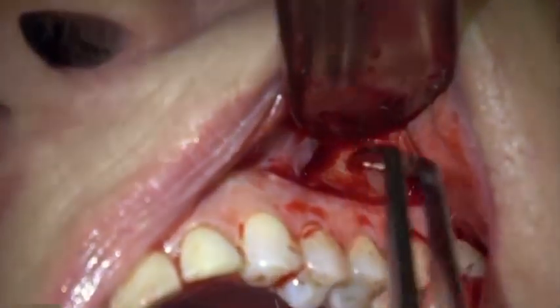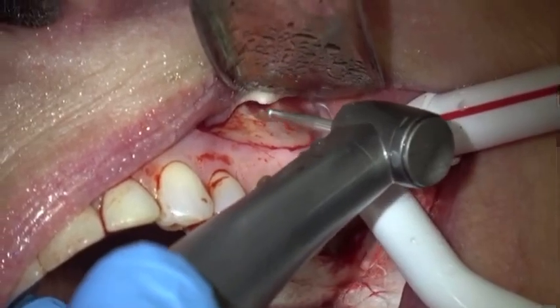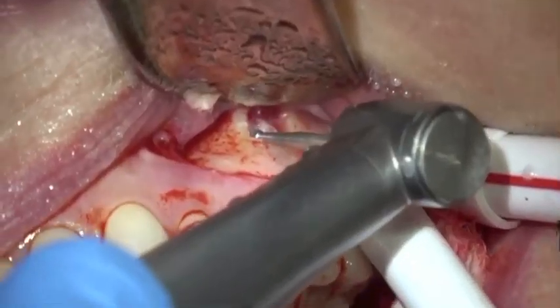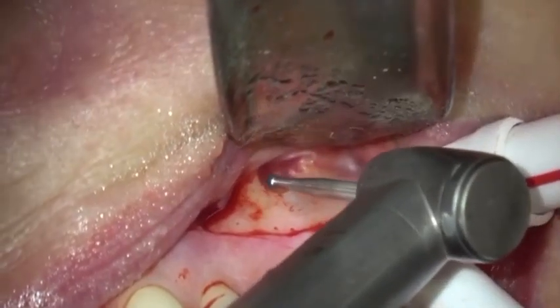I'm removing that and I know I'm in the right location. You can see here's the root — you can see the gutta percha down there and there's the root of the tooth. Now I'm just cutting off the root tip.